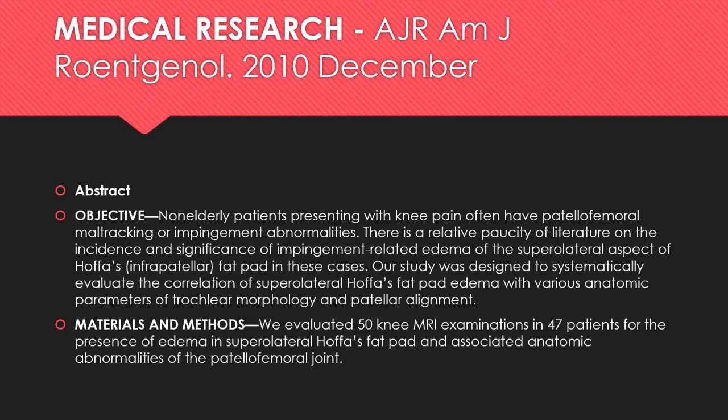So they conducted a study to find out if there was any association between the condition of patella alta and the MRI imaging finding of edema in the infrapatellar fat pad, also known as Hoffa's fat pad. So they tell us that non-elderly patients, such as this patient at 55 years of age, who present with knee pain often have patellofemoral maltracking, such as patella alta, or impingement abnormalities.